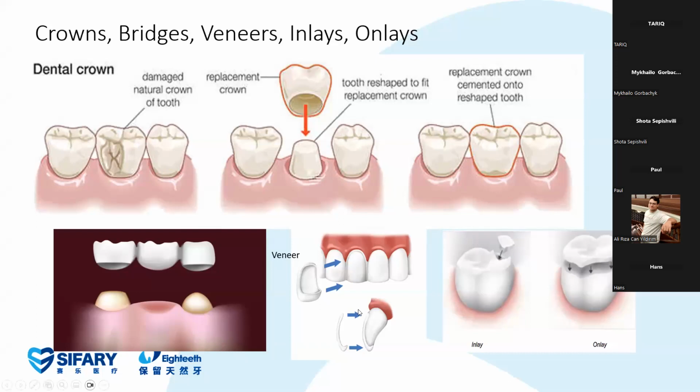It's kind of a crown, but a very small area in shape. For the posterior areas, the backside of your mouth, it could be a small part or a bigger part of a crown that is inserted. If it's small, we call it an inlay. If it's a bigger part of the tooth, we call it an onlay restoration. Just keep in mind, you can take a picture however you like, but these are the restorative types.